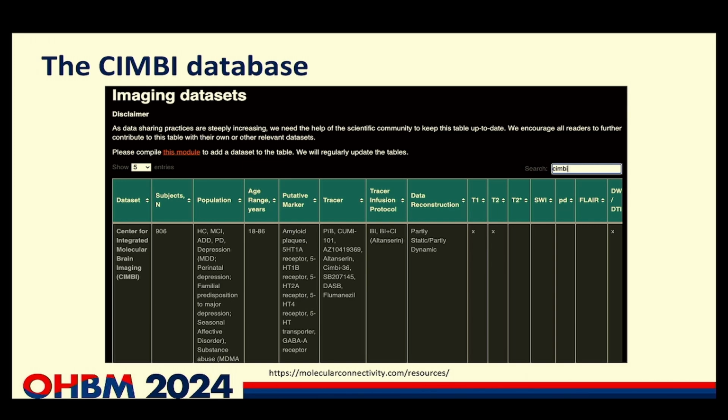Thanks. Yeah, thank you for that question. So Martin, could we say that it's not like you can merge everything together? You need to check if the characteristics of the scanners, the reconstruction protocols and everything are more or less comparable, right? Right, and that's a whole other discussion that we can dig into because it's different from site to site. What scanner do you have available? It impacts the resolution. What kind of protocol did you do to acquire this? Sometimes it's static, sometimes it's dynamic. And you can discuss how much you can merge this data. From a statistical point of view, you can try to take it into account by including that information later, or you can try to standardize it in the pre-processing stages. But it's the same issues that we're dealing with in the fMRI community. How do you actually combine data from different sites?